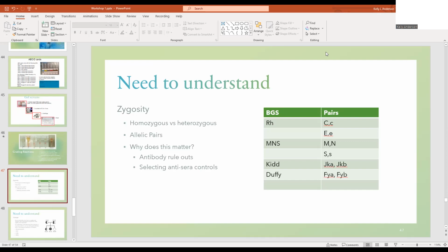We have a gel. Gel will come with this gold foil on top. So an ABO card, this whole card will be used on one patient. They record the patient names. And then up here, if you add anything to it, or you're going to add A1 cells, do so.